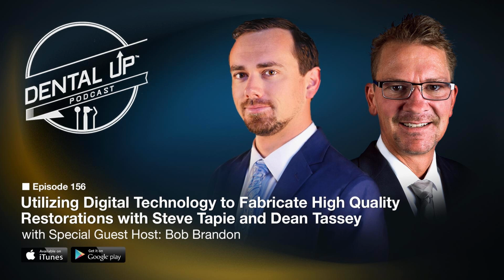We have a specific set of default values that we follow to begin with. And like you said, those first 5 cases, we really try and dial that in. And it can be down to a micron, plus or minus, either way, for various anterior, posterior, or multiple contacts. Yeah, and that's truly how specific we can get. And we've seen big differences in what a normal person would consider a negligible gap. But we're talking 10 microns here. And we've seen extreme results from customers being just thrilled that we're decreasing their contact strength by 10 microns. Right. And the restorations are just then slipping right into place.